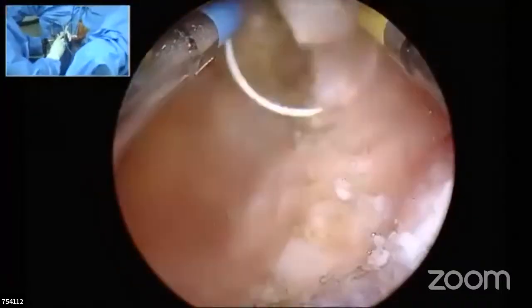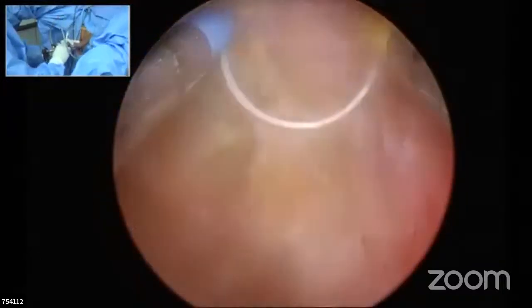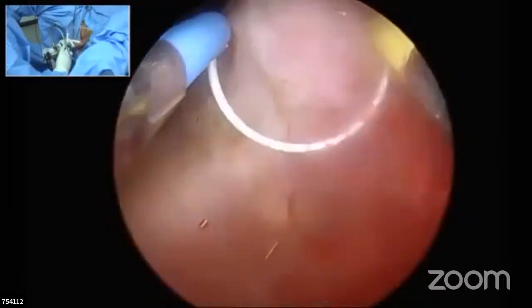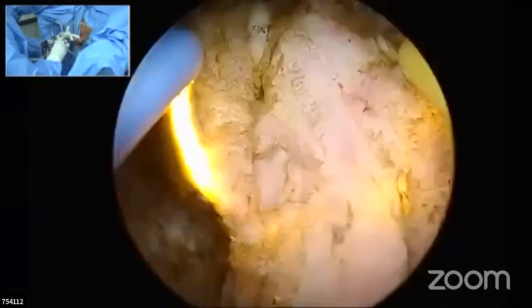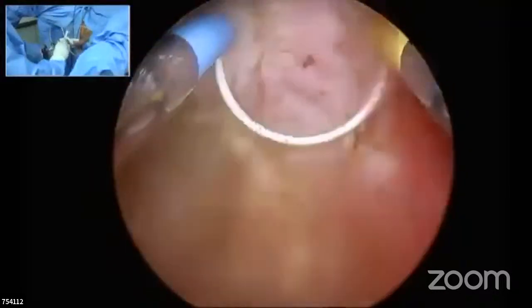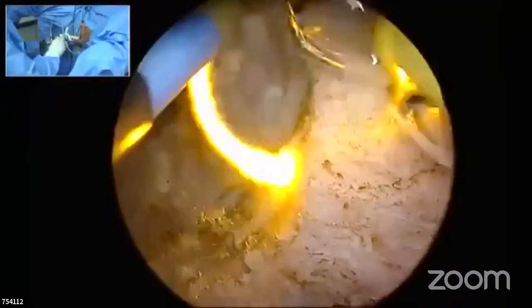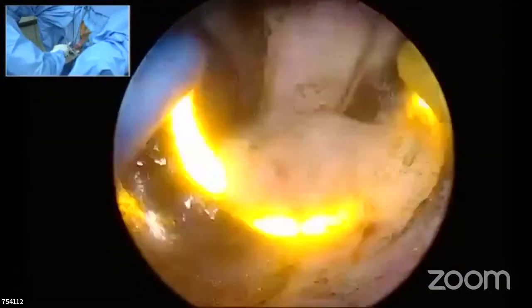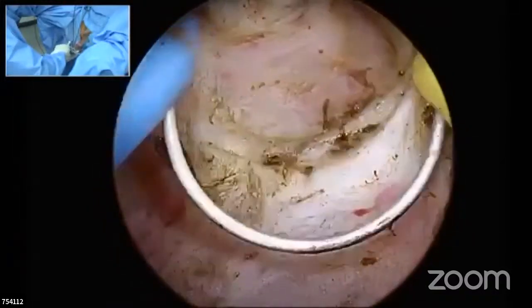I wanted to just tell them, whenever you do an apex, like somebody was asking, when it goes beyond the verumontanum, what happens? Whether it is beyond the verumontanum or not, the technique of resecting the apex is the same, so that you can keep as much smooth muscle as possible inside. That is, the length of the sphincter is going to be intact, and the longer the sphincter, the better the continence is going to be. So that is what is necessary.